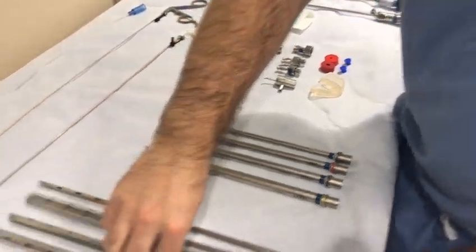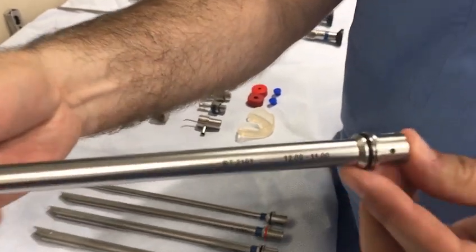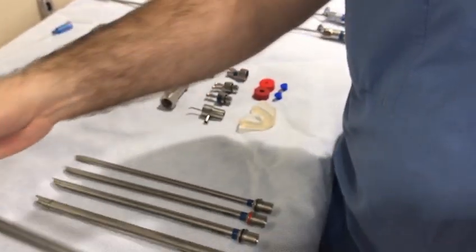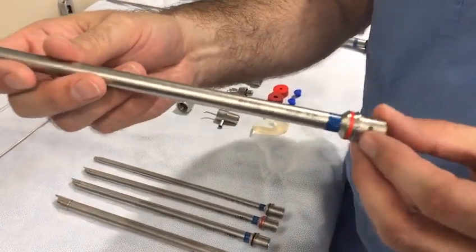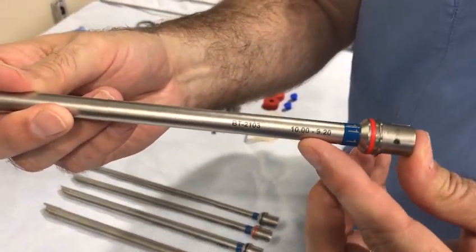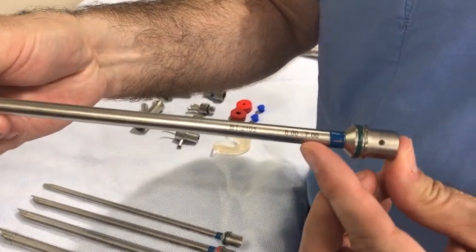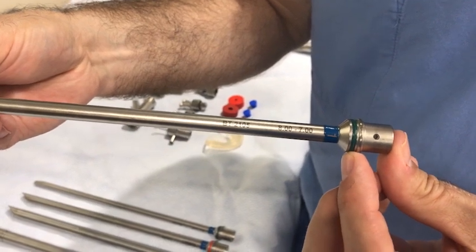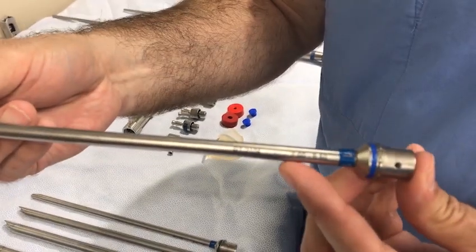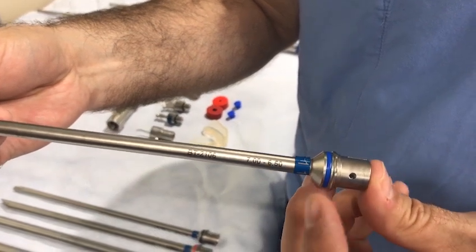The black scope has an internal to external diameter of 11 to 12 millimeters. The red scope has an internal to external diameter of 9 to 10 millimeters. The green scope has an internal to external diameter of 7 to 8 millimeters.